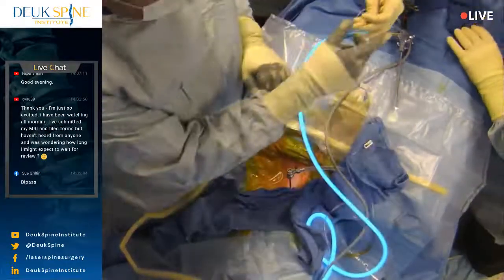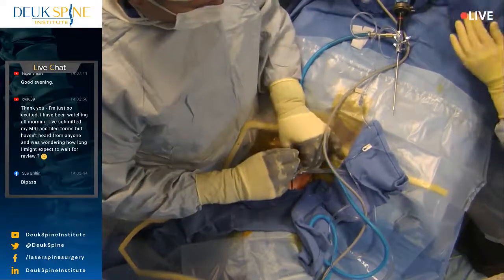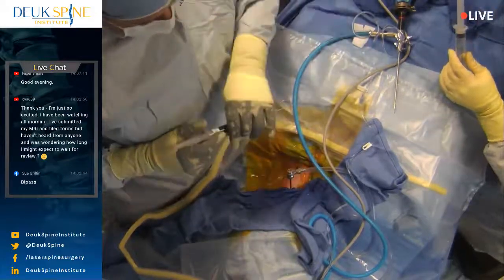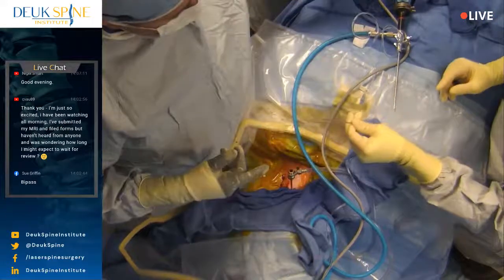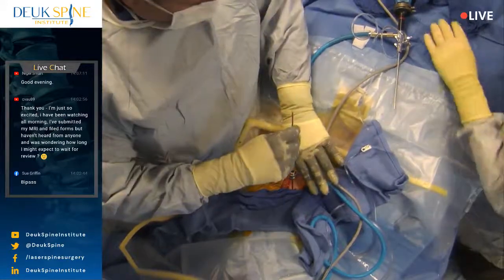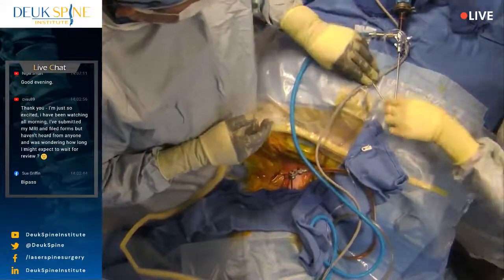So, I'm very happy. The other side of the disc at that level, I got to about the middle, and there was no herniation on the other side that I could see. So I feel really good about it. Feel like we got everything done we needed to, and I think she'll do fantastic. See how she recovers. But this is an outpatient surgery, in case you didn't know.